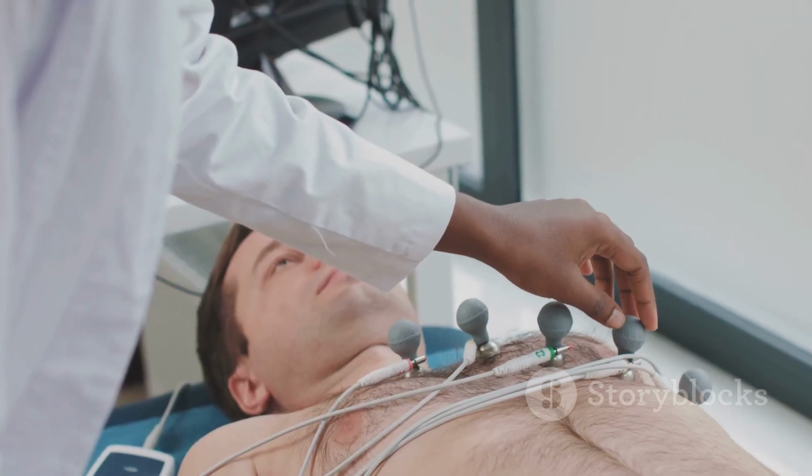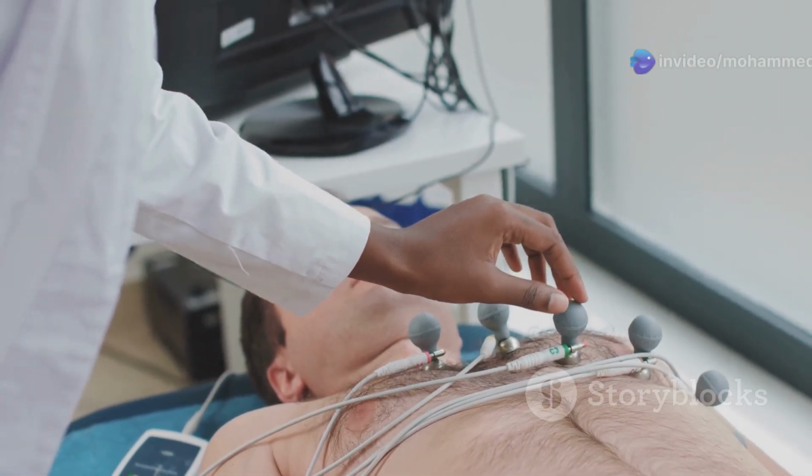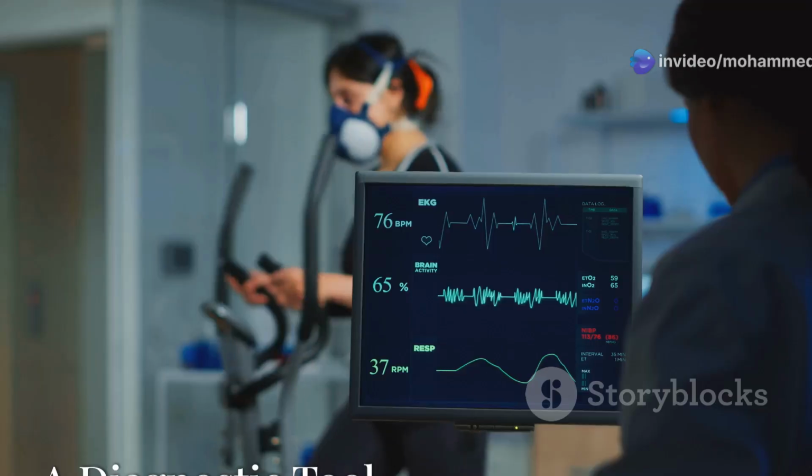By analyzing the duration, amplitude, and morphology of these waves and intervals, doctors can identify irregularities in heart rhythm, conduction abnormalities, and signs of heart damage.